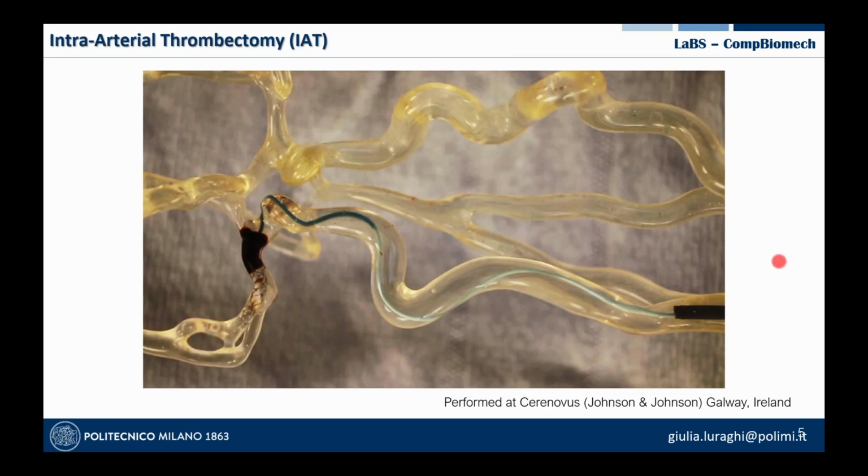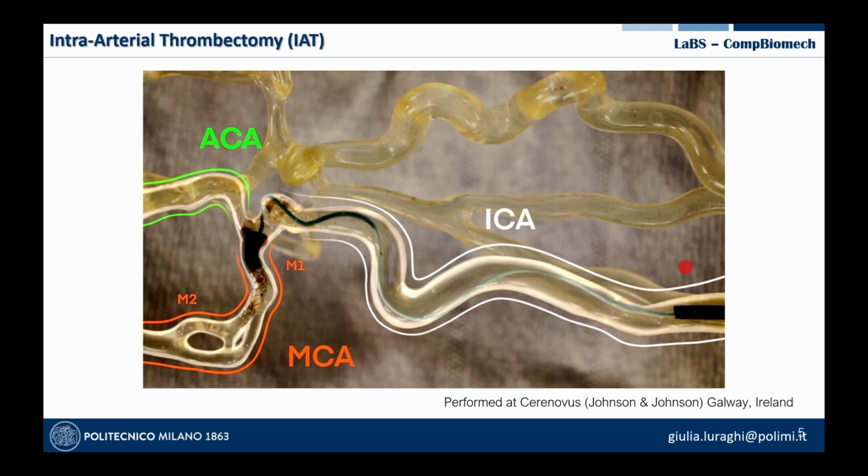The tests are performed at Cerenovus in Galway. You can see that this is a 3D printed silicone model of cerebral arteries. The 3D printed domain is composed of the internal carotid artery, the middle cerebral arteries, and the anterior cerebral artery.